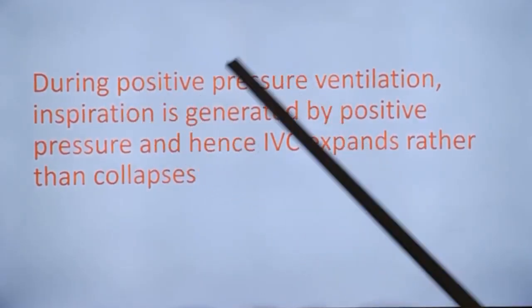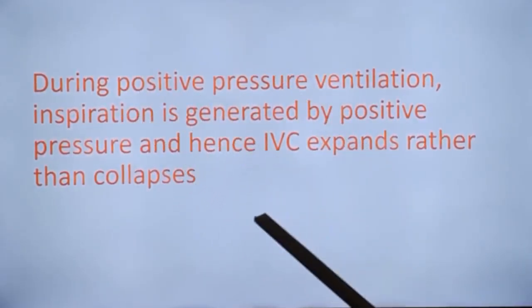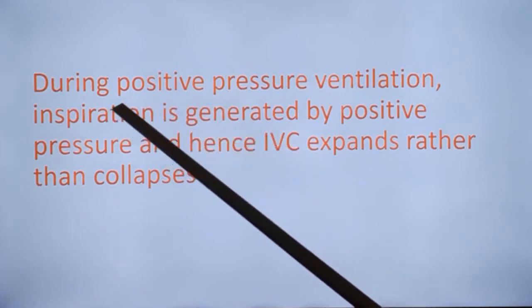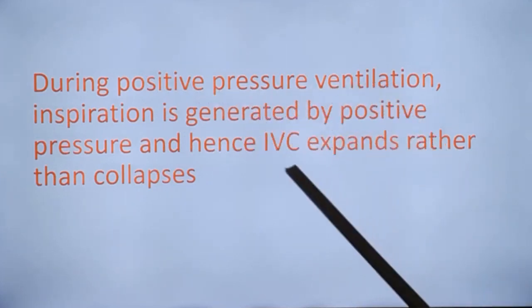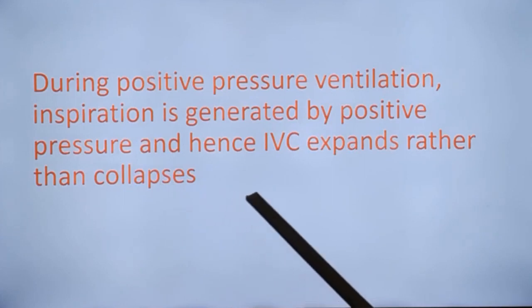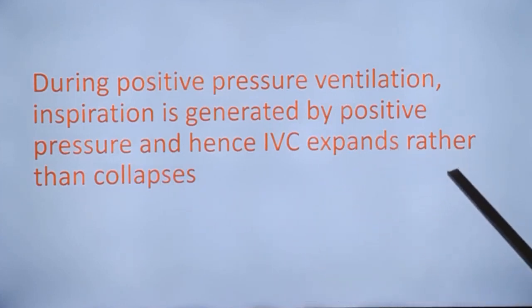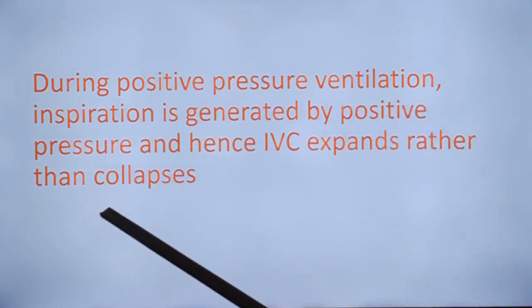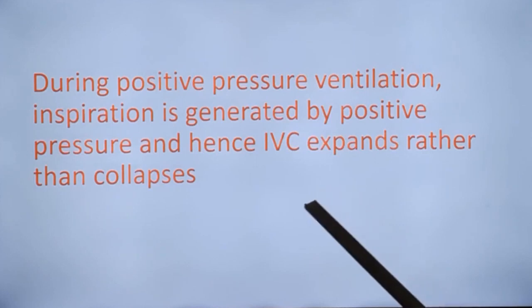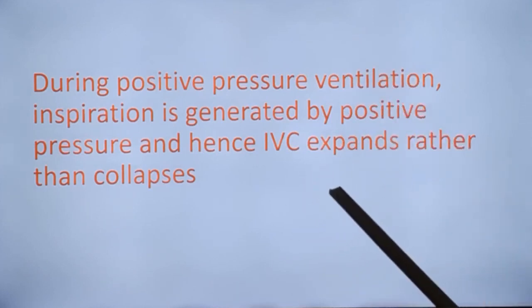This is an important point to be noted regarding IVC dimension in a critically ill person in the ICU. During positive pressure ventilation, inspiration is generated by positive pressure. Hence, IVC expands rather than collapses in inspiration. So, your assessment of IVC plethora may be wrong when you have a positive pressure ventilation.